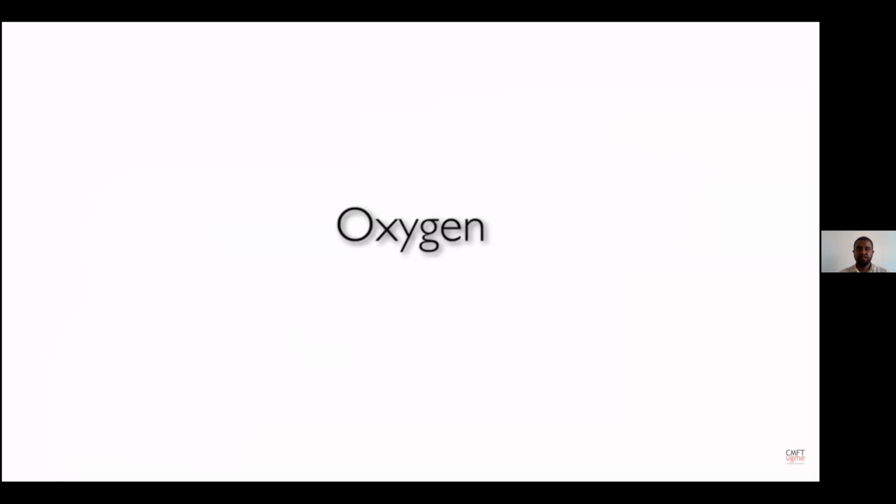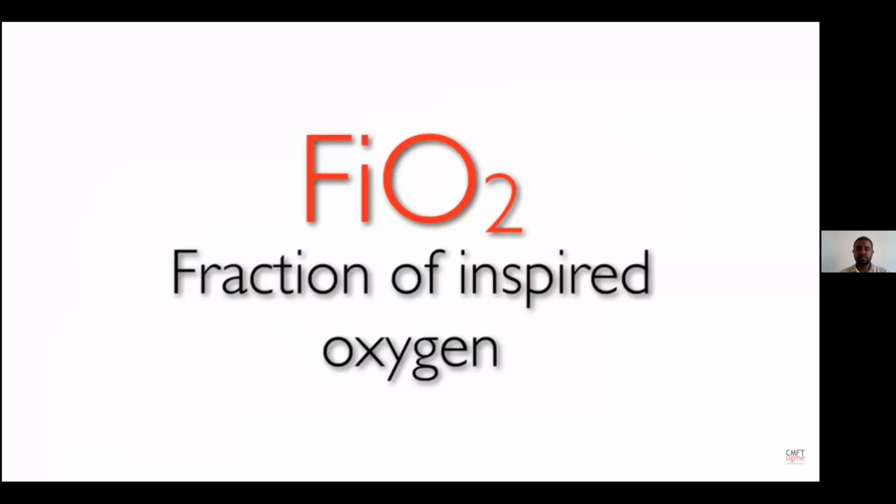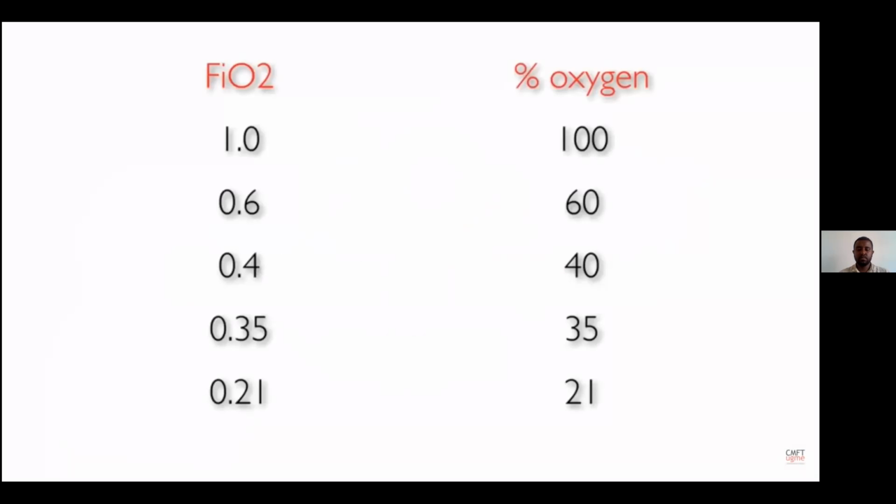In addition to the pressures in both non-invasive ventilation and CPAP, oxygen levels must be set. For various reasons, this is frequently referred to as the FiO2, or fraction of inspired oxygen. The FiO2 is expressed as a fraction, so that 100% oxygen is expressed as an FiO2 of 1 and 21% oxygen is expressed as an FiO2 of 0.21.